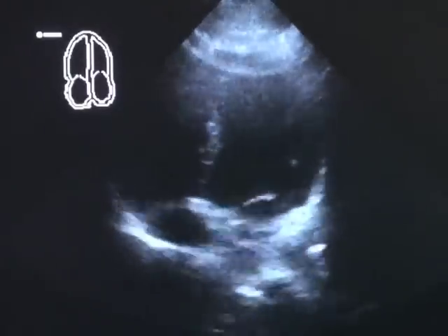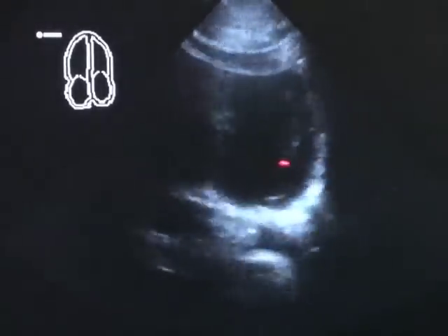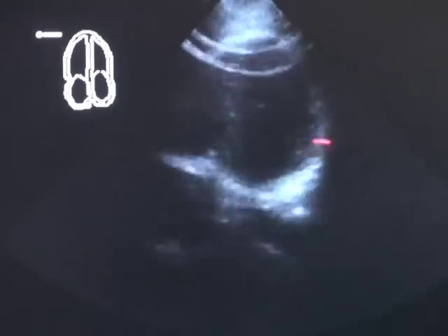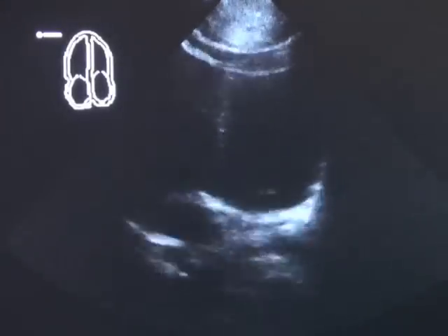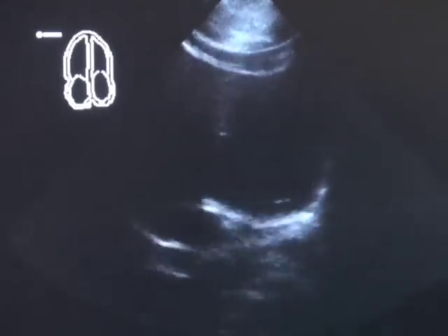You can visualize the left ventricle to right ventricle ratio. You can measure these at the valve tips, at the mitral and tricuspid valve tips, measuring from inner wall to inner wall. And this diameter of the left ventricle to right ventricle is normally a 1 to 0.6 ratio. With acute and chronic pulmonary hypertension, this can be a 1 to 1 ratio.